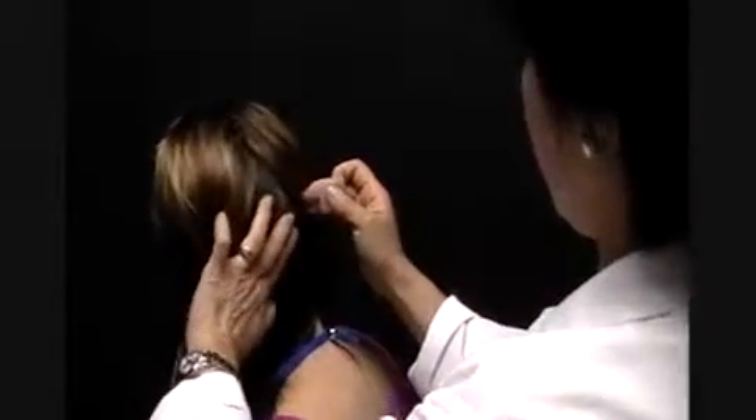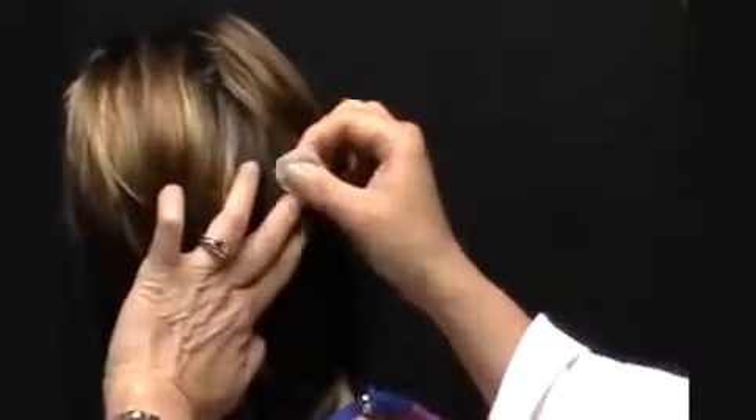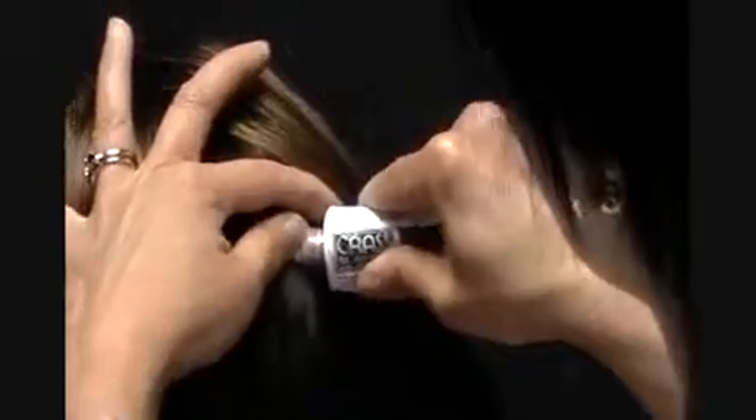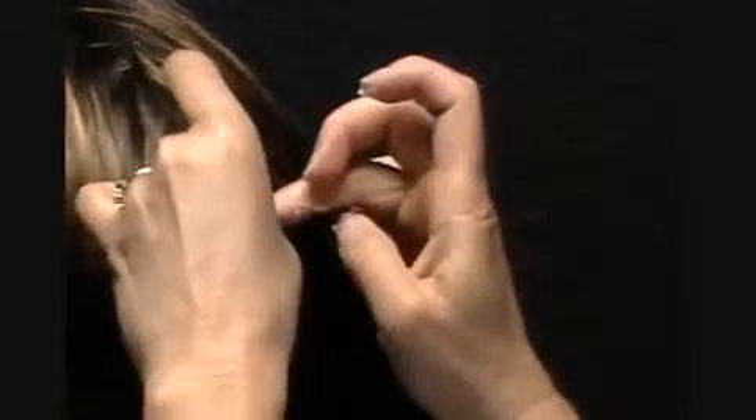The last is the testing recording electrode, and we're going to place it right here — two finger-breadths above the inion. The inion is the protuberance of the occipital lobe. We're going to find an area where there's not so much hair, then we separate it with our fingers. We abrade it with the alcohol pad. It's okay to see a little bit of pink, because you actually need some sort of contact with the skin. And here is the gel, and here is the electrode. We place it right here.